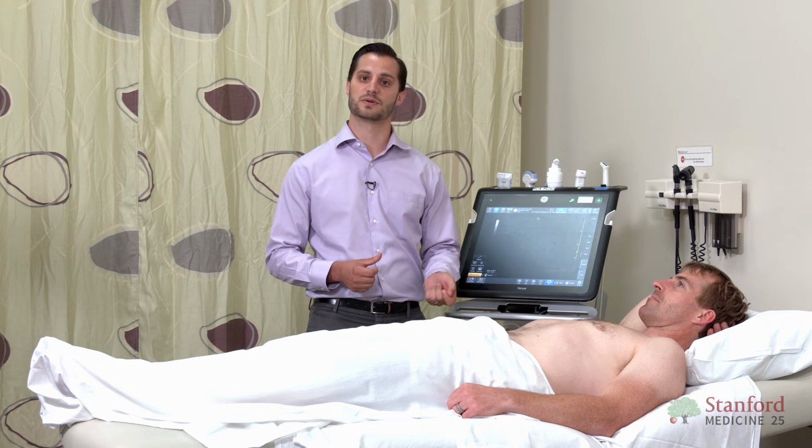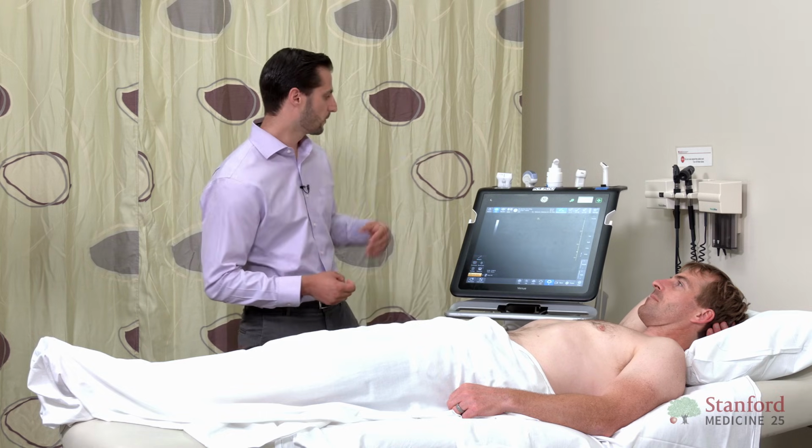Let's discuss acquisition of the kidney. There are two probes you can use. You can either use a phased array probe or cardiac probe, or a curvilinear or abdominal probe. A phased array probe has a smaller footprint, which allows for easier visualization between rib spaces, while a curvilinear probe has a much wider view and greater depth and penetration. For this particular video, we'll be using a phased array probe.